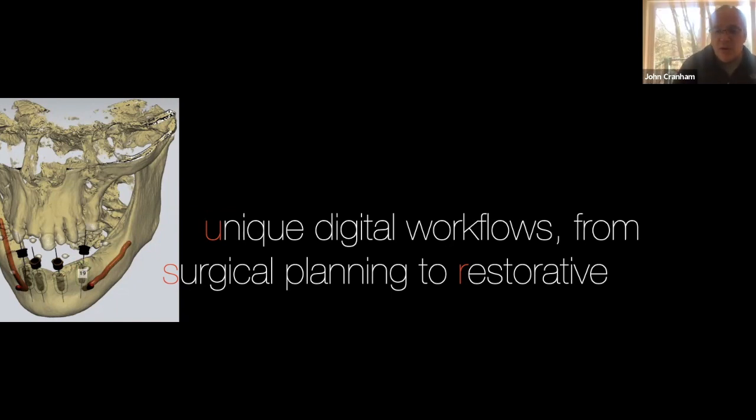And that was the one that when we tried it in, I just couldn't believe it because we were so close. But I don't know why I was surprised, because we do this all the time in restorative, where the teeth are a mess, we do a wax up, put the provisional in, and it looks fantastic. That's what I want you to think about. Even if they're hating the denture, if you can get a good impression and a good bite, even if it's not at the right vertical, then the upper and lower arches are related properly. And then we can open the bite or do whatever we want.